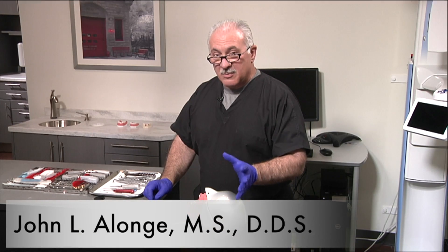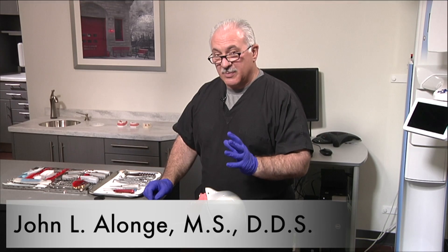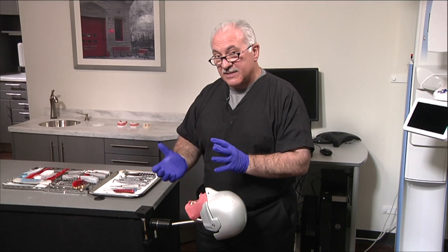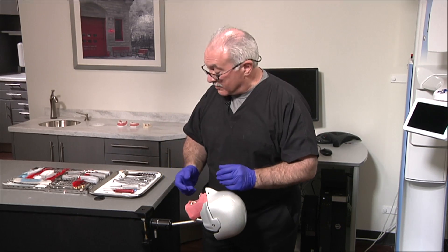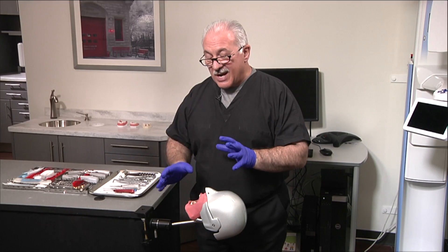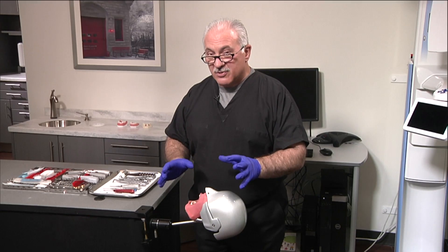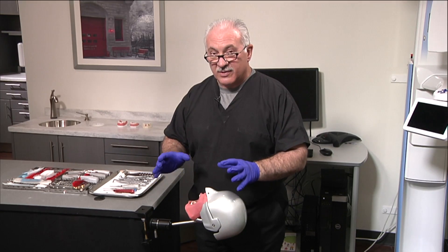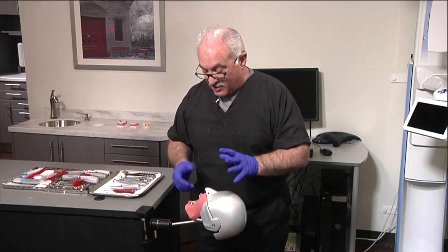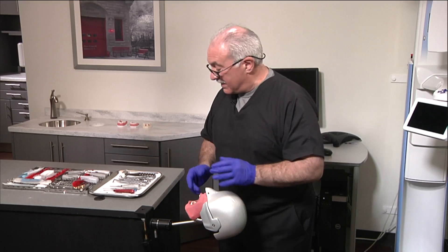I'd like to show you some positioning of yourself and your patient to facilitate the techniques of minimally invasive exodontia so you'd be more successful. First and foremost, try to put yourself in a balanced position. We're creatures of habit — we have some old tricks that are hard to break where we contort and do all this and that. I'm in a standing position where you would be at the 10 o'clock position sitting down.